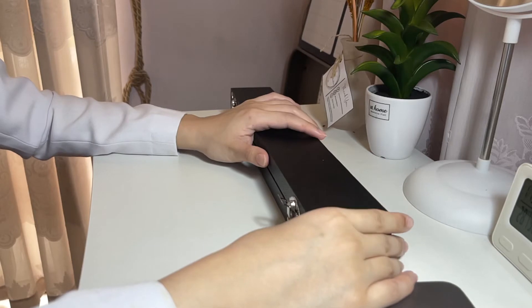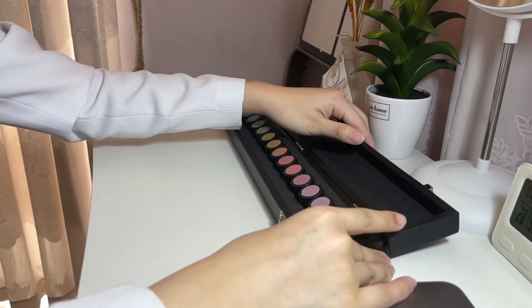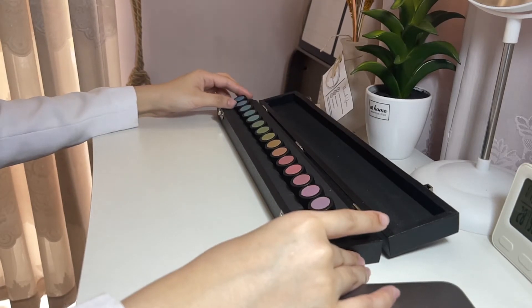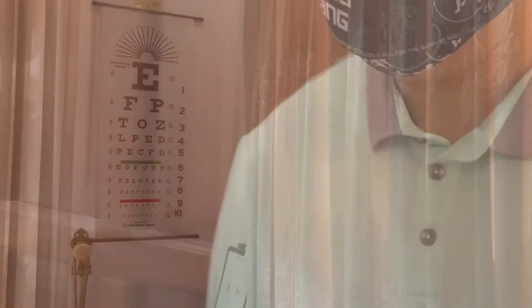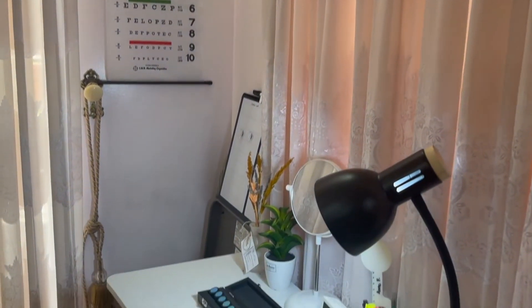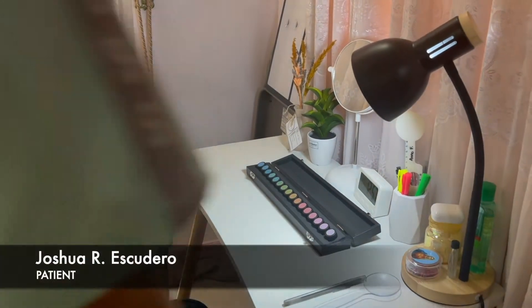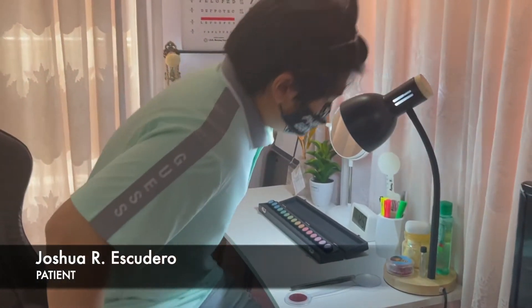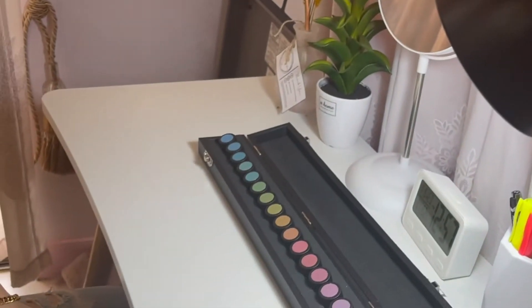Let's take a look at the procedure. Place the guide top on the left-hand end of the tray.